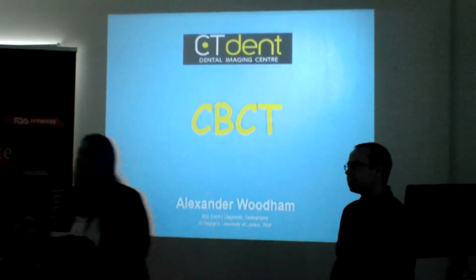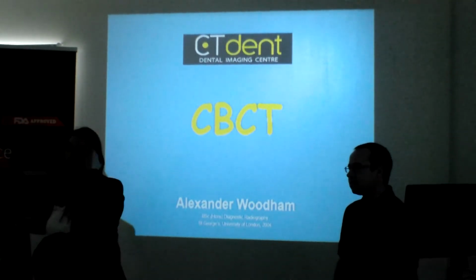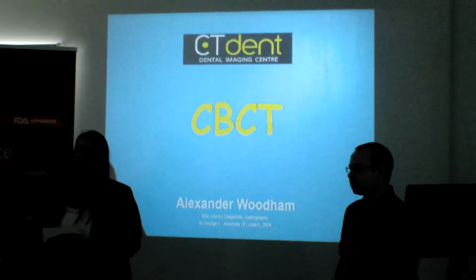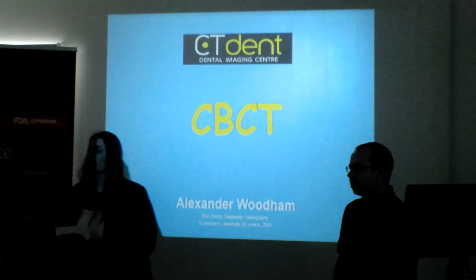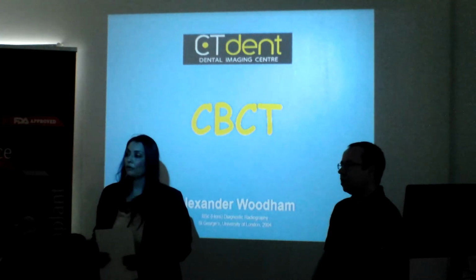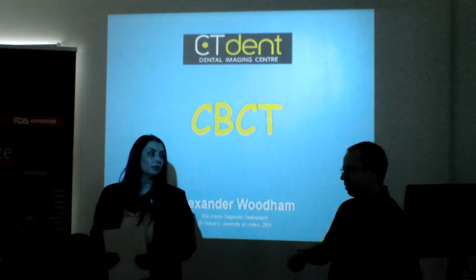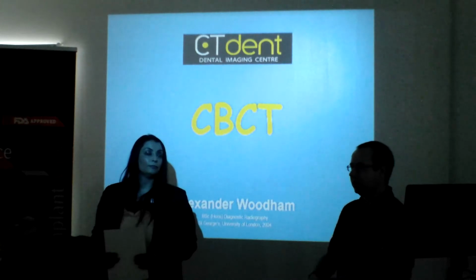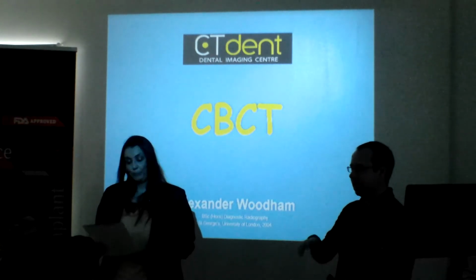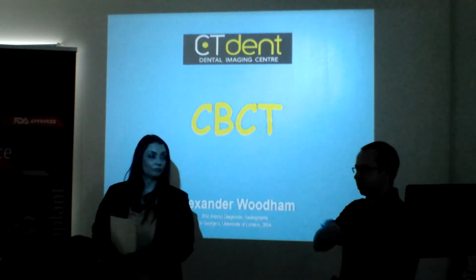Just a quick question. Yes. If you email the patient link, that is not the patient CT scan. That's only the link for logging in to CTDent, isn't it? Or do you send the scan by email? The link basically goes to our server, and the scan is stored on the server. So when you click on that link to download the scan, you're effectively logging into our server to extract files.